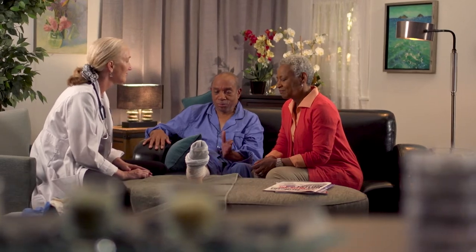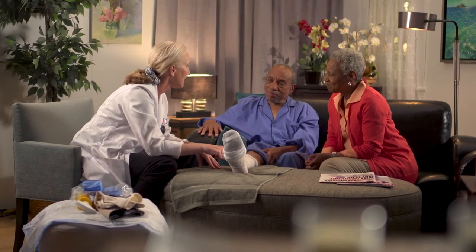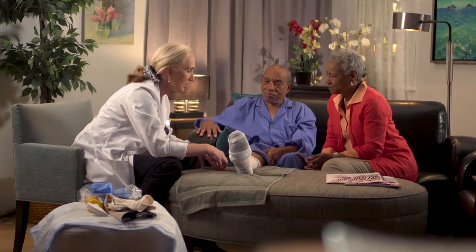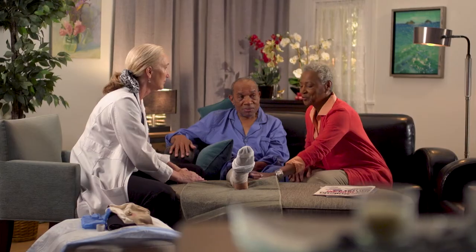Mr. Wilson, how are you feeling today? Well, I'm feeling a little better now that those compression wraps — it seems like they're doing the job. Yes, I think he's been feeling a bit better since he's been home, and I know he loves having his foot up. Keeping your leg up and keeping the compression wraps on will really help the edema and the swelling that happened in your legs before you came to the hospital. So I'm just going to show you a different way to apply the wraps. I appreciate that — the nurse in the hospital put this one on and it did look complicated, so thank you for showing us.